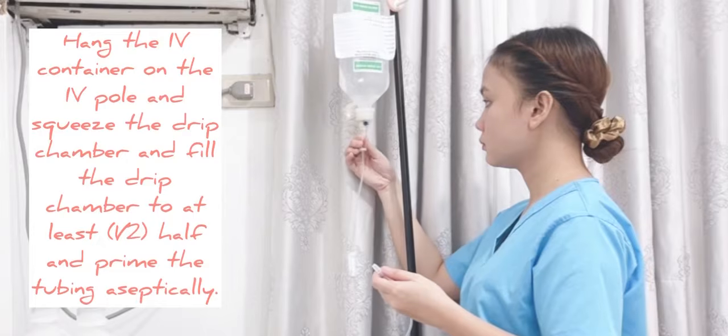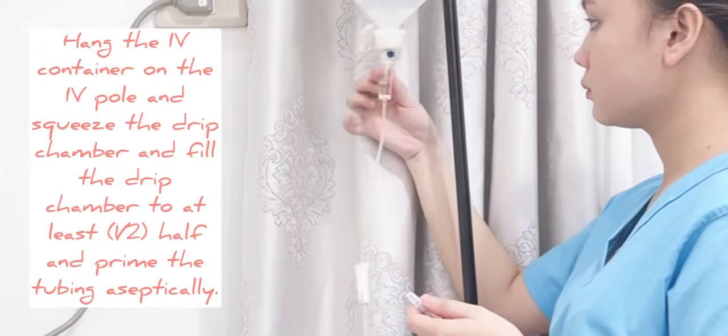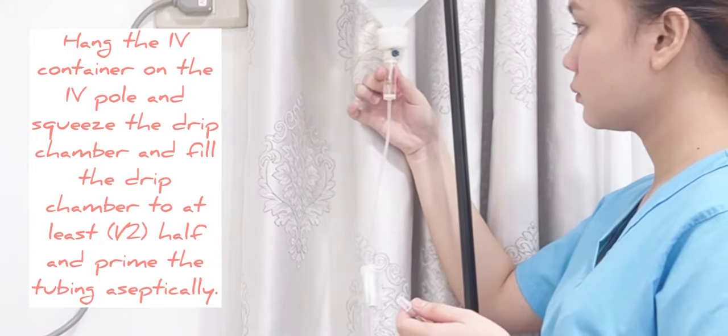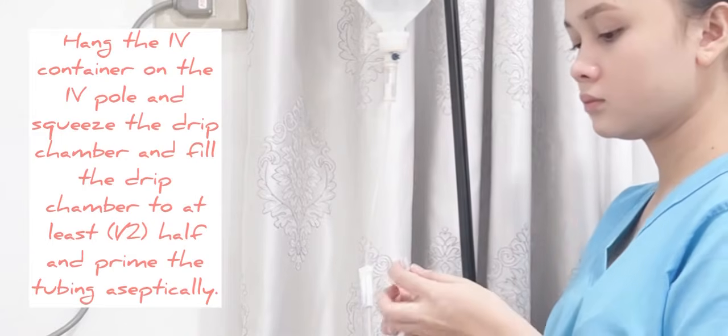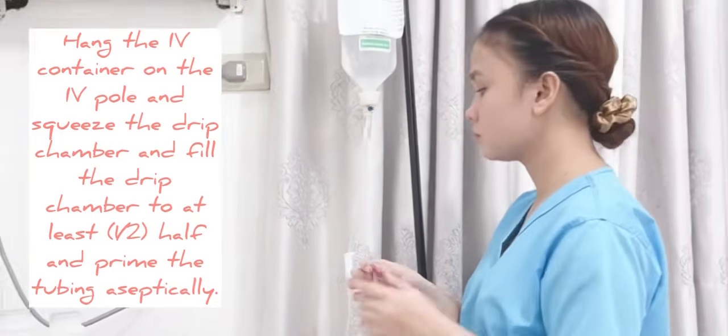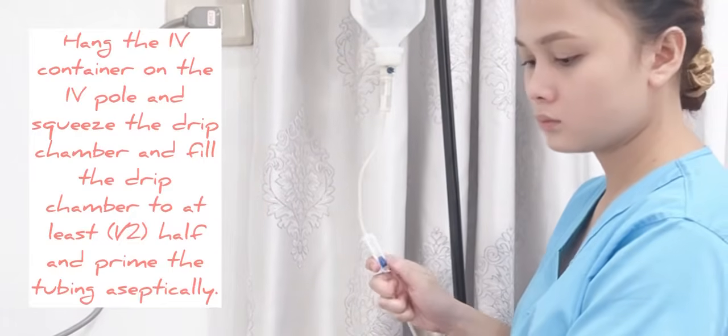Then fill the drip chamber at least one half. This creates suction effect. Fluid enters drip chamber to prevent air from entering tubing. Then prime the tubing aseptically. Open the IV tubing clamp and allow fluid to move through tubing.